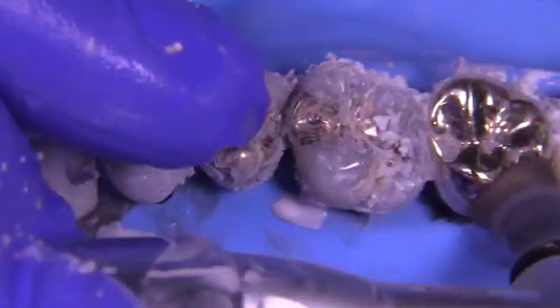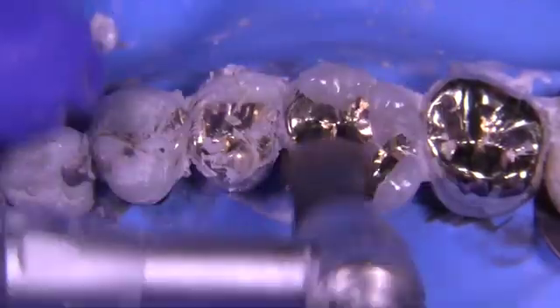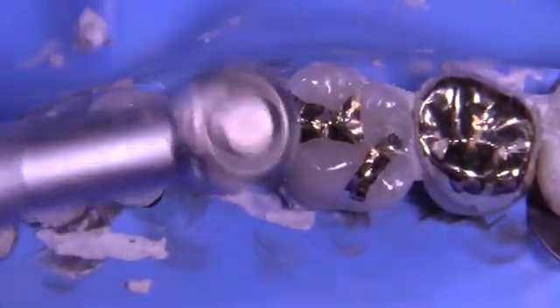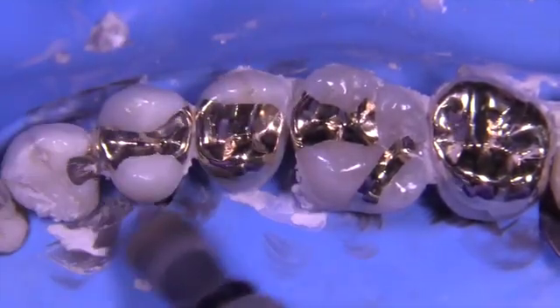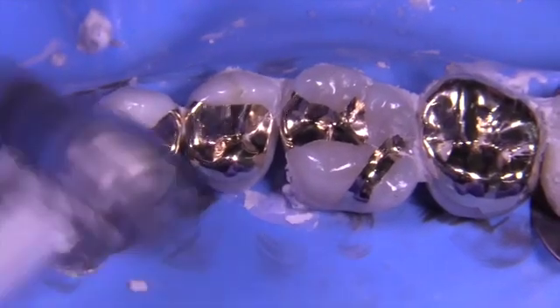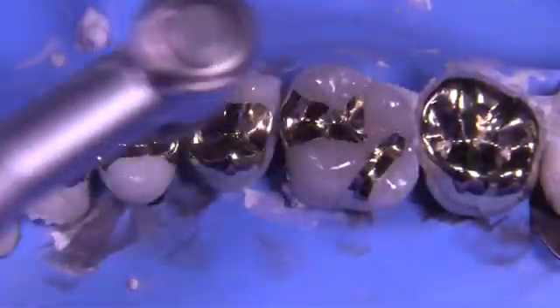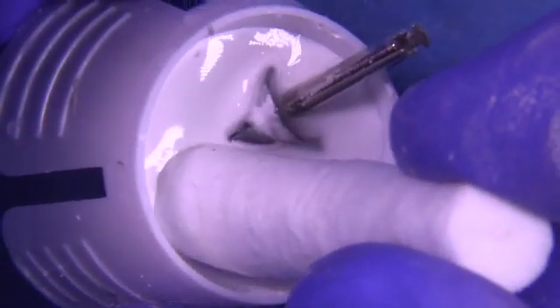This is the application step — the dental assistant stands by while you apply. Then utilize the air spray simultaneously with the disc moving over the surface very lightly, not too much pressure, and you'll see a much higher luster. I must emphasize that trying to do this kind of dentistry without a rubber dam is nearly impossible — moisture control is critical, and even the patient breathing will interfere with your ability to get a fine finish.